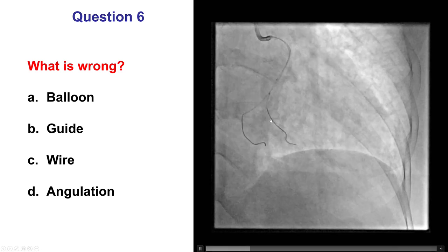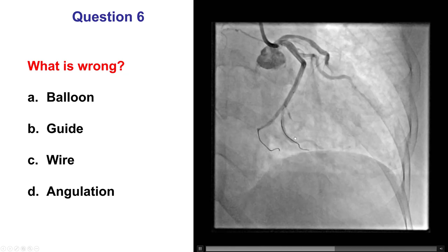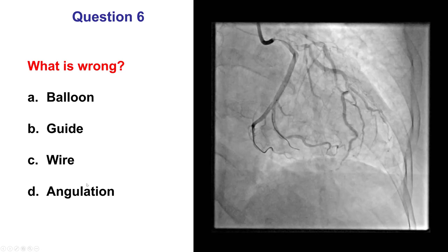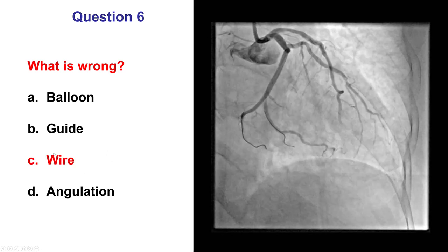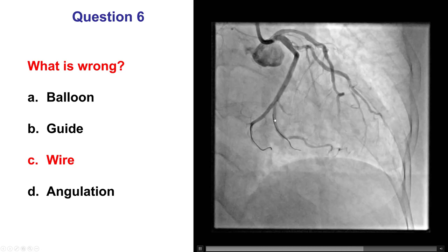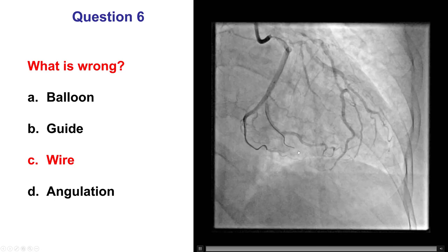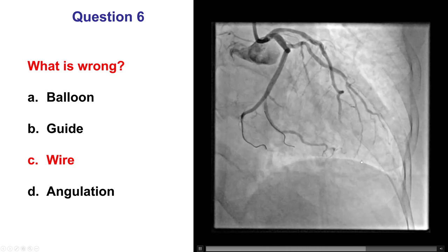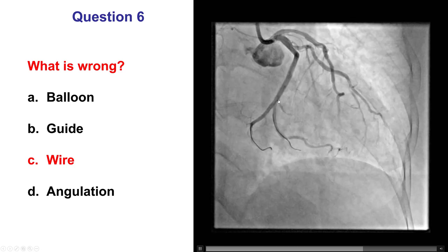Now we have wires in both vessels and restoration of antegrade TIMI 3 flow in OM2, but there is something wrong. The question is whether the issue is the balloon, the guide, the wire, or the angulation. The answer is the guide wire. Looking at the OM2 wire, it is actually in a small side branch of the second obtuse marginal branch. Although this often does not cause problems, it can cause distal vessel perforation, which can be challenging to treat. The next step is to reposition the wire further down into the OM2, which will also facilitate stent delivery.